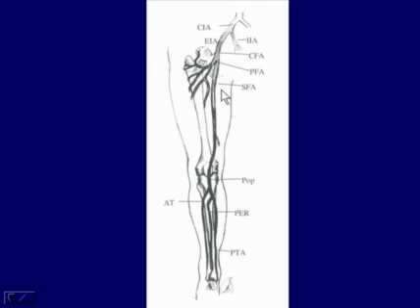We'll scan through the entire length of the superficial femoral artery. Somewhere about the adductor canal, though, it will come deep and come up behind the leg, so we'll have to change our approach. And then we'll scan the tibial level vessels.